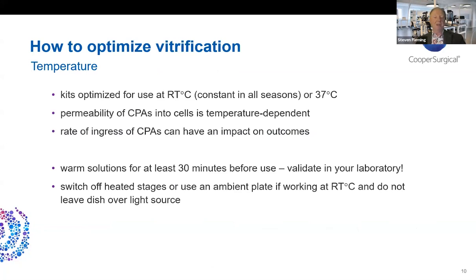However, of course, the temperature will affect the speed of the process, and therefore the normal distribution of time for equilibration, for example, will be faster at 28 to 30 degrees C, let's say in a warm or pretty warm lab, than at 20 to 24 degrees C, let's say in a cooler or more typical range of room temperature.